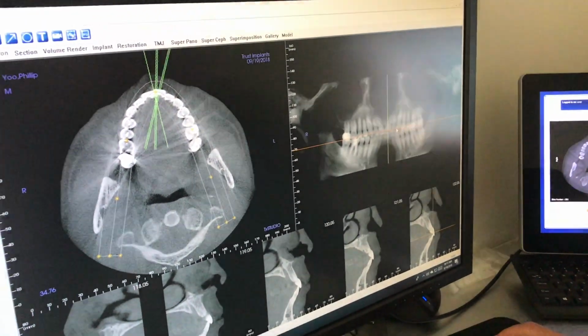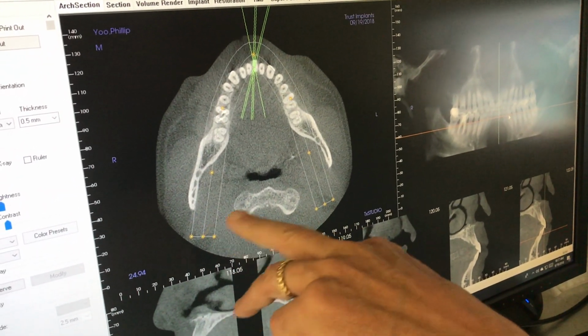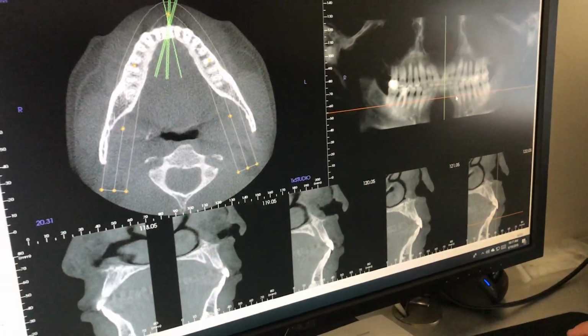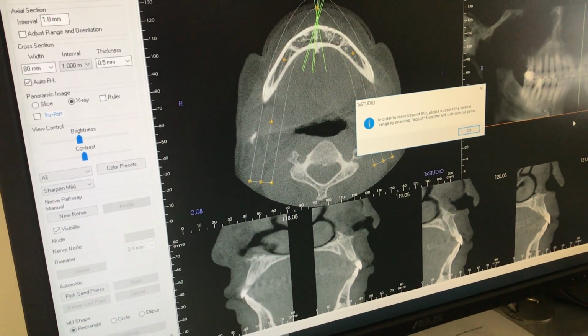You guys should have this for looking at. Can you see where your atlas is crooked? Oh yeah. Okay, it's tilted. Yeah, rotated. And we can go through all of your scans.